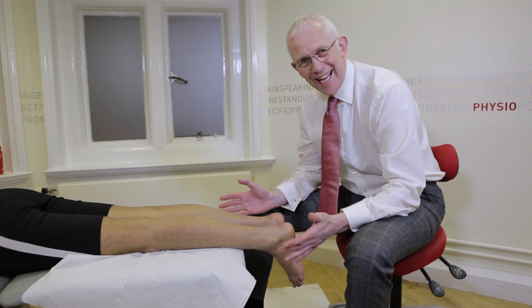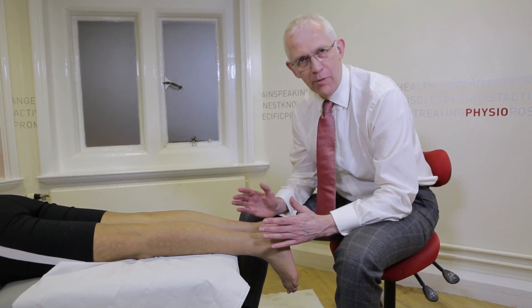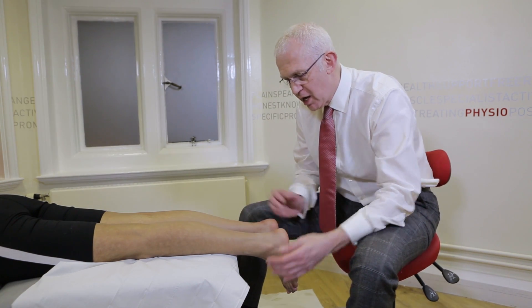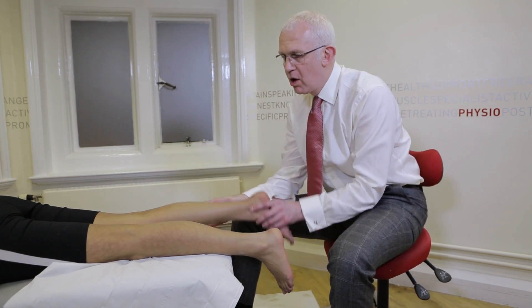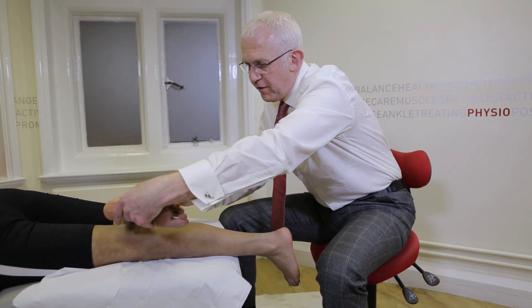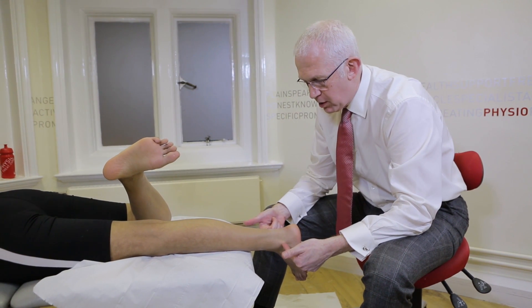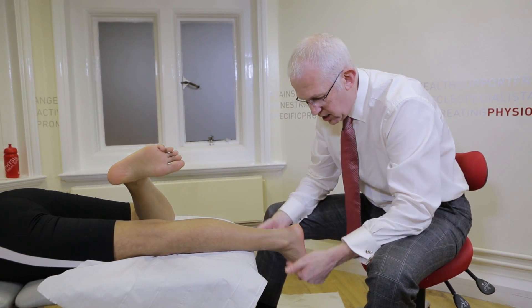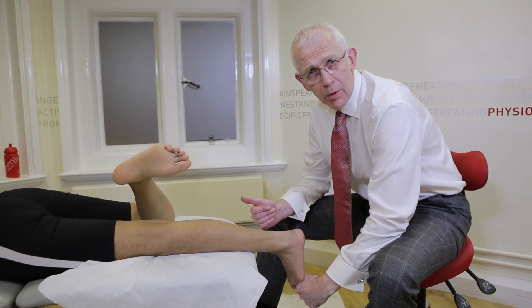In order to try and standardise the position, we're moving away from Root, Weed and Ryan's sub-talar neutral position. You can feel for the head of the talus to try and get that consistent. What we tend to do is to flex the opposite knee and leg, rotate the leg until the malleoli axis is parallel with the floor, where we can lock the foot into a fairly repeatable position.